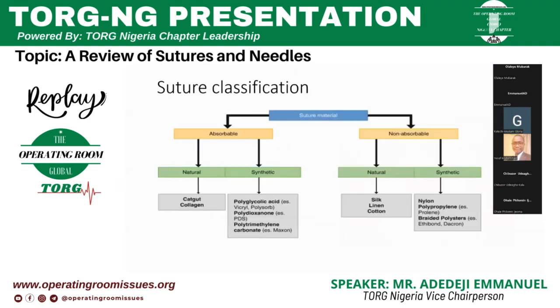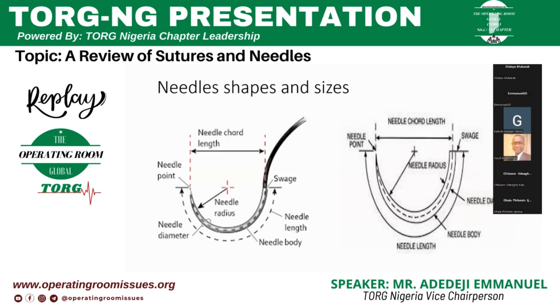At this point in time, I wish we can make it a conversational thing. I don't know how many minutes I still have, but if we can make it as interactive as we can, maybe let's share experiences of what our experiences have been with the use of surgical sutures and needles, naturally occurring versus synthetic sutures, and the use of different needles for different purposes.